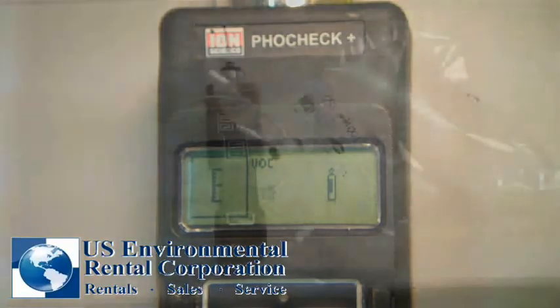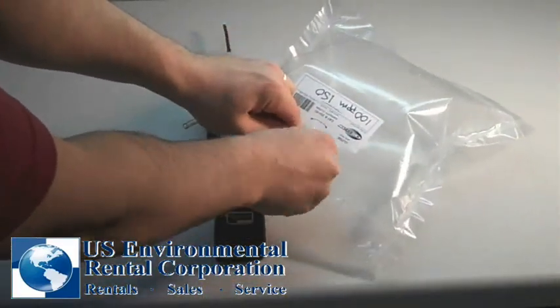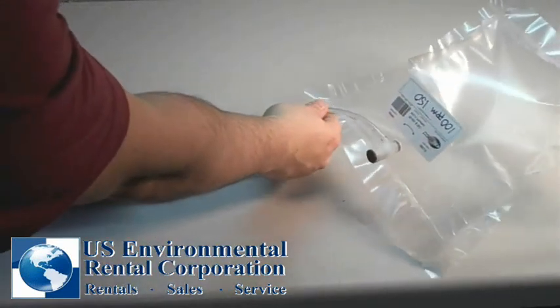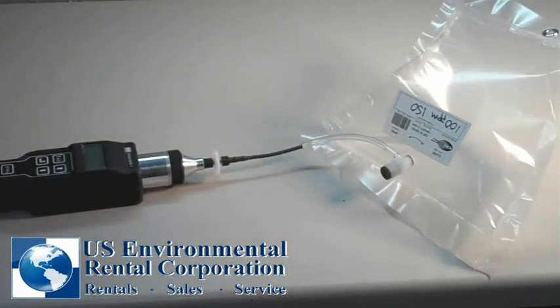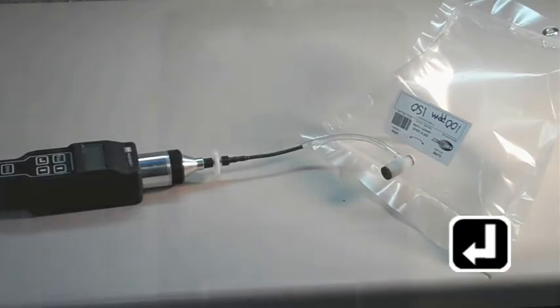Now, open the valve on your Tedlar bag and make a secure connection to the probe tip. Press enter to begin the span calibration.